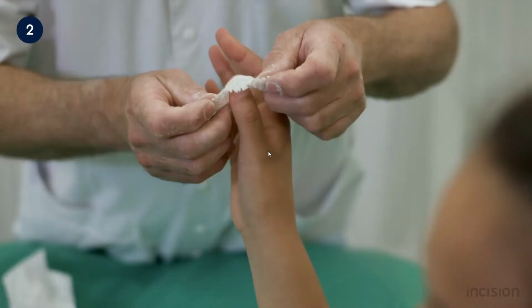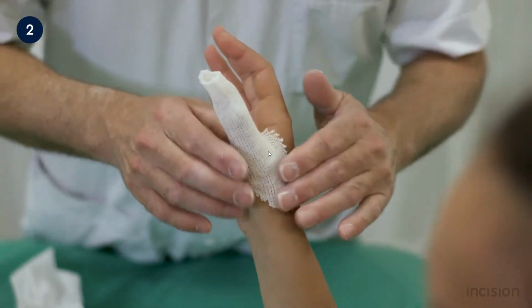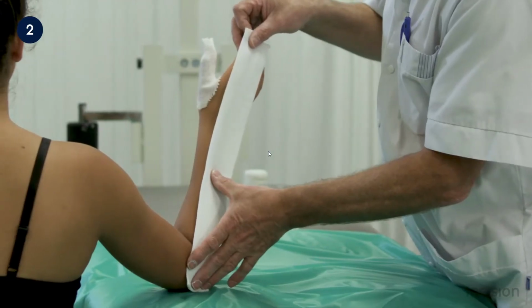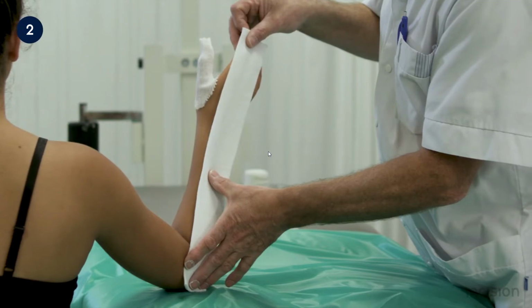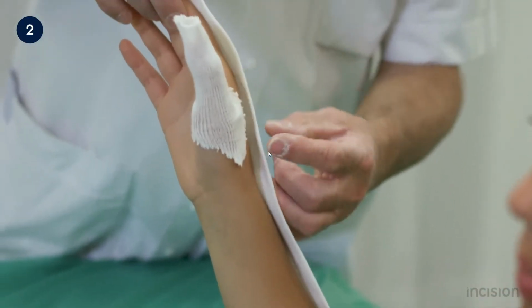First, the small stockinette is applied around the thumb. Note that the oblique side is located proximally. The length of the stockinette which will be applied around the forearm is measured. The stockinette should cover the entire forearm and should be long enough to cover all digits. A hole should be cut in the stockinette at the base of the thumb.